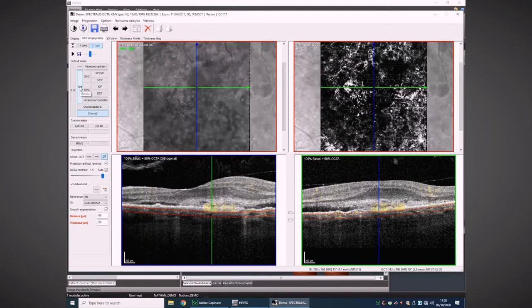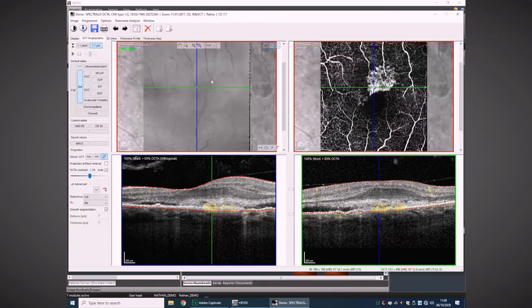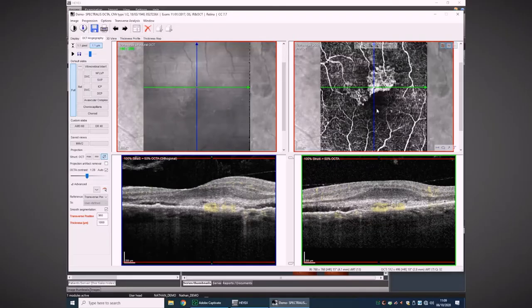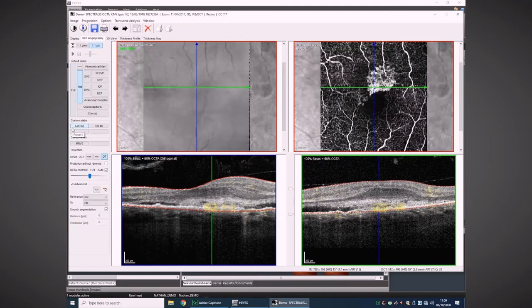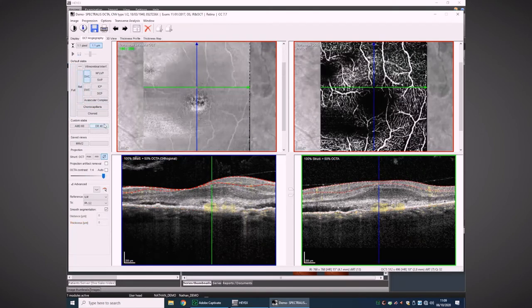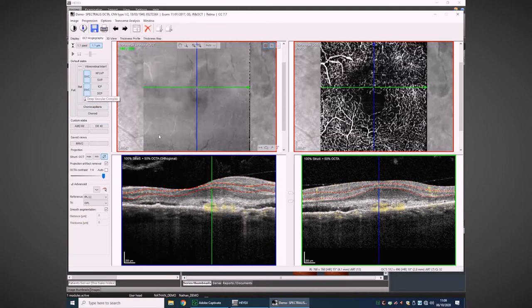If you look at the full retina you have everything in there, so you can see that this lesion seems more visible when you consider the entire retina. But if you use the full extent from the vitreous right through to the choroid, that includes information at the level of the choroid, and you see a different view — another lesion which may be below the retina. So you have the opportunity to review right through to the choroid, through the superficial and deep vascular complexes, to the avascular complex.